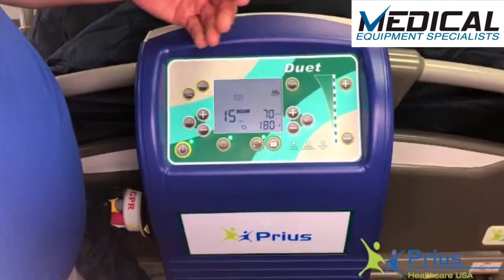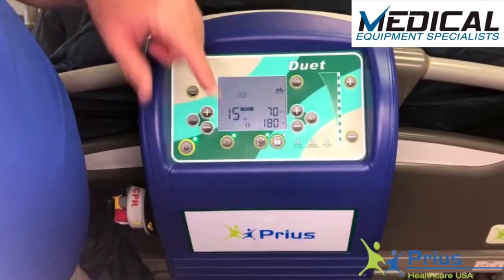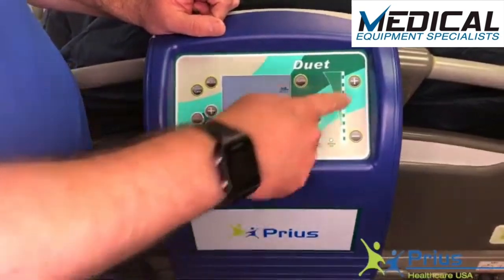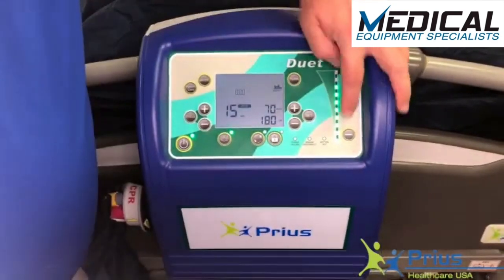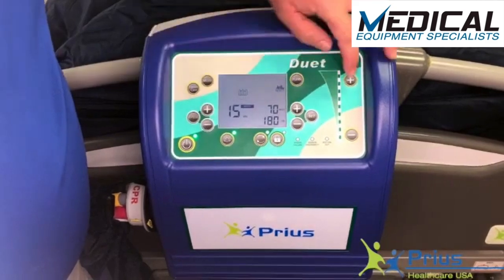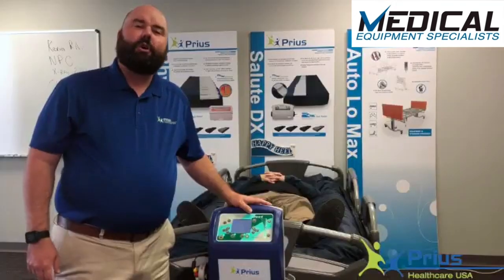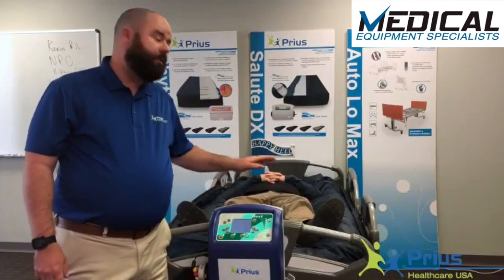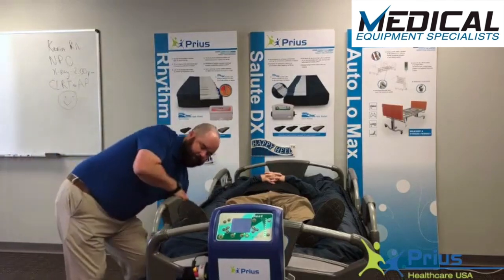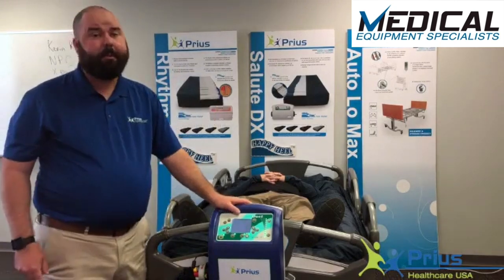If the patient feels the mattress is too firm or too soft, you can override the auto set feature. Push the auto set button to turn it off, and that allows you to increase or decrease the amount of pressure in the mattress, indicated by the LED light. This unit has 10 settings of pressure. When putting the patient into the turning function, first ensure that all side rails are raised — never engage the turning system without the side rails in the fully up position.